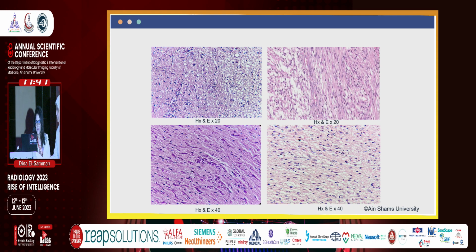Thank you so much. Okay, we had a biphasic tumor, as you can see, with a compact area having some elongated cells with bipolar cells, another loose textured area with microcysts, another demo of the loose textured area with multipolar cells and microcysts, the dense area, again a dense area and a loose area.